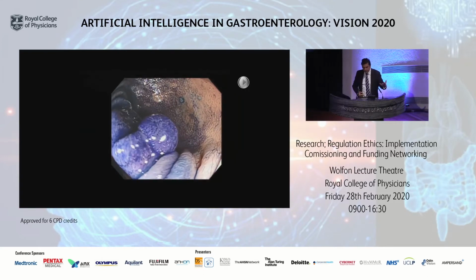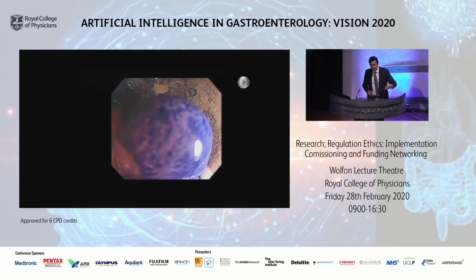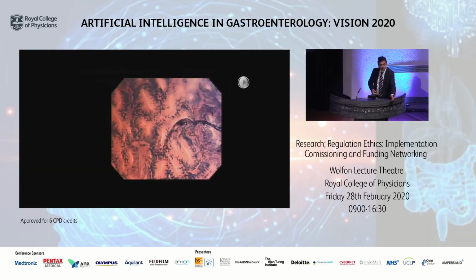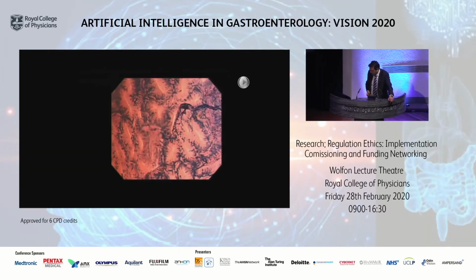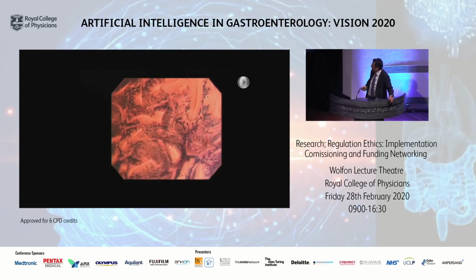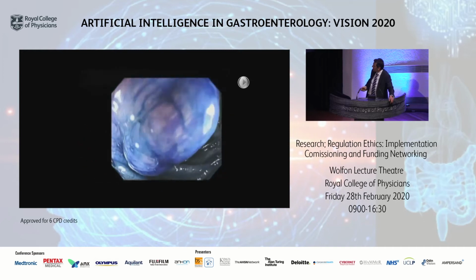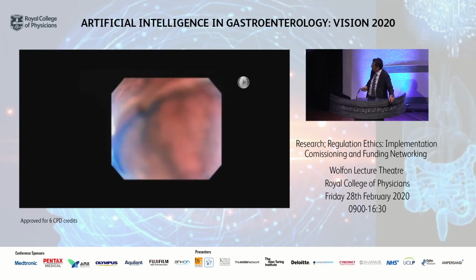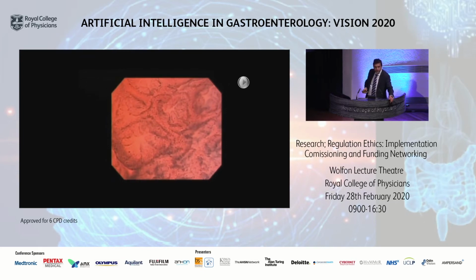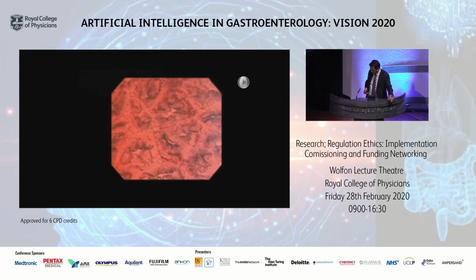So, in real time, what do we do? It's methylene blue dye. You magnify up, this is 80 times zoom, then you magnify up further, which is 520 times zoom, and this is a tubular adenoma where you can see the methylene blue staining the nuclei quite regularly. This is another polyp, again on magnification, and you can see a slightly serrated lumen, slightly different to the previous exam.